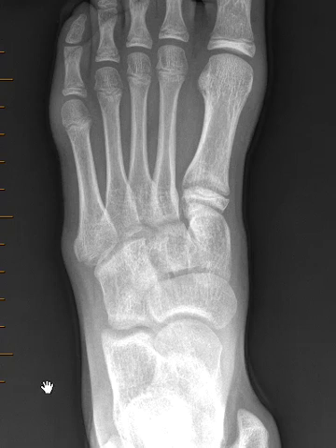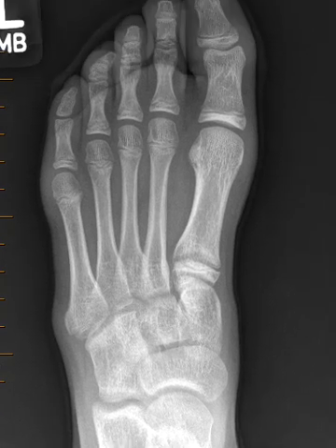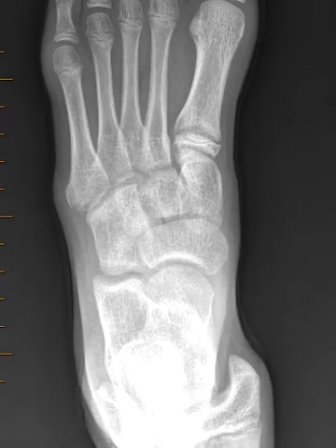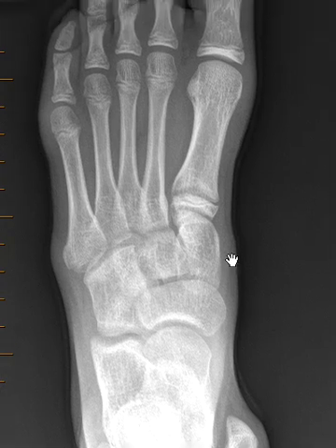Hello, this is Dr. Gang from First Look MRI. This is a 10-year-old female who injured her left foot playing sports. She continued to have pain, so they did an x-ray to see if there's anything wrong.